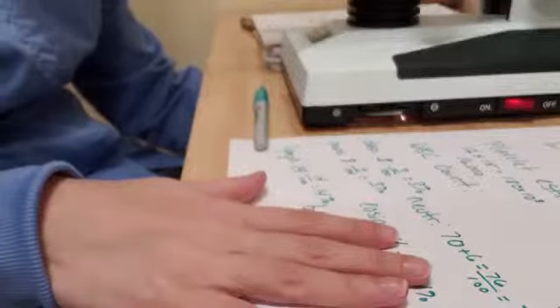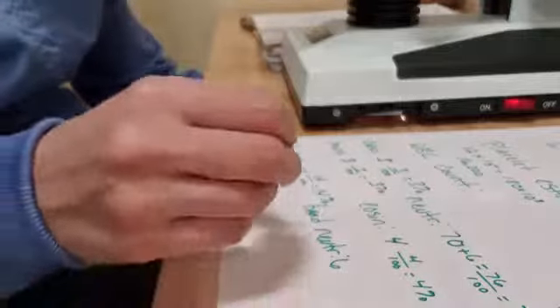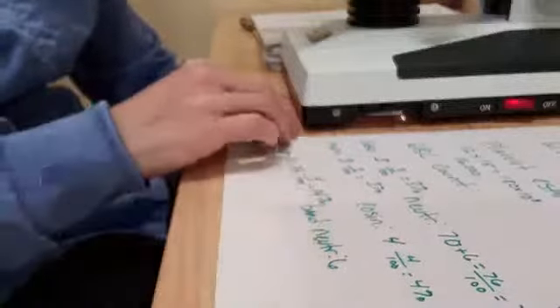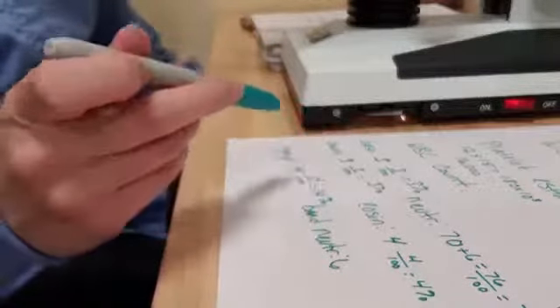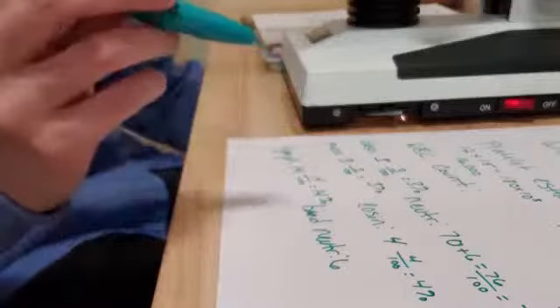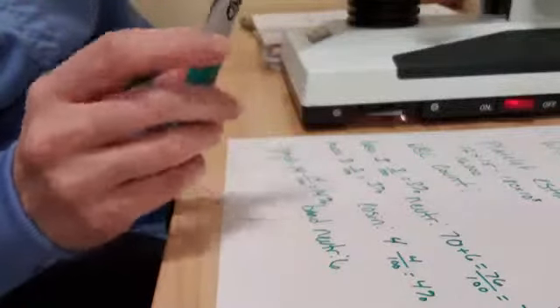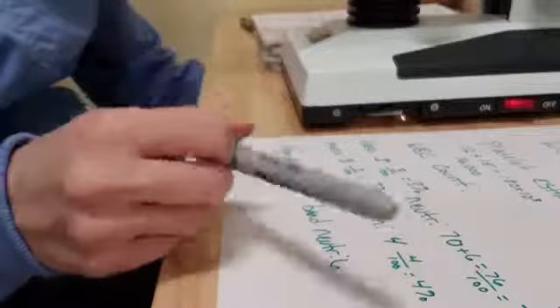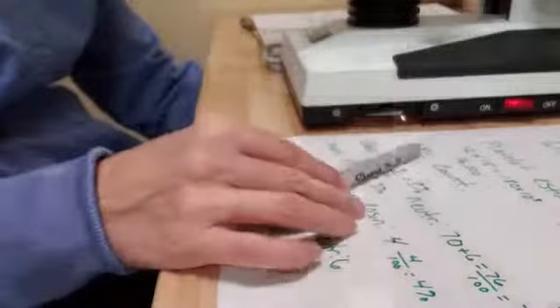But in cases where you are seeing a lot of abnormalities, you want to make sure that you record all of those. So we'll record this in our record, and we will go over each type of white blood cell and discuss the causes of what some increased numbers might be.